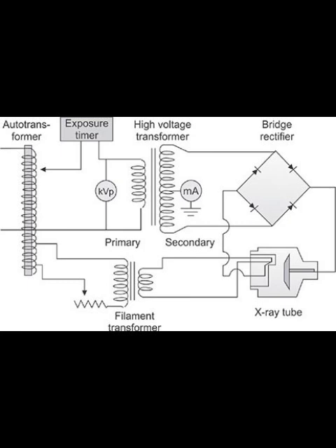Not very smooth. No. Three-phase power, on the other hand, uses multiple AC waveforms, three of them specifically, that are offset from each other. Out of sync. Deliberately out of sync, yeah. So they overlap. And the result is that the voltage never drops to zero. It stays much closer to the peak voltage. Ah, so it's a much more constant, steady power supply. Exactly, nearly constant voltage, which makes it significantly more efficient and stable for demanding applications like high-power X-ray generation.